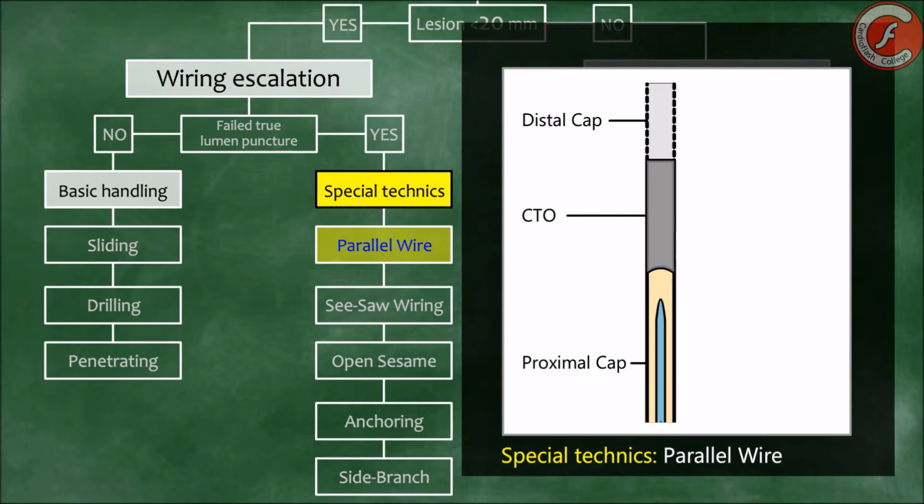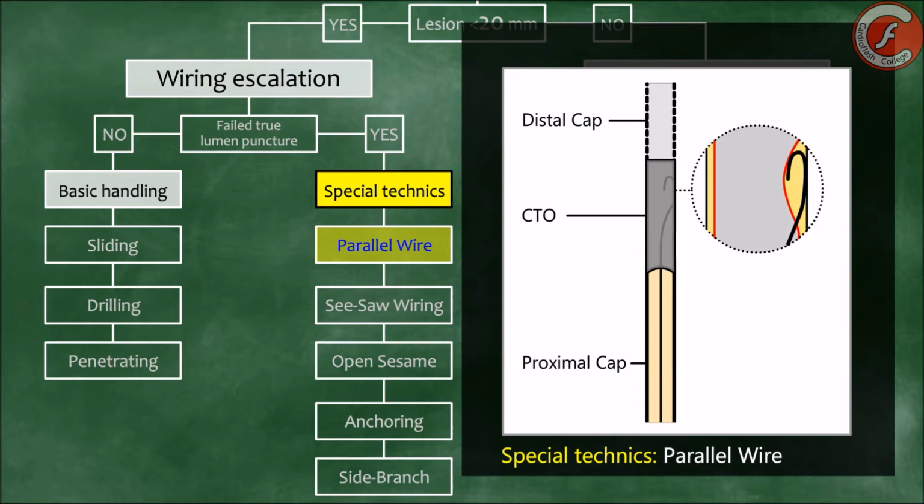It consists of leaving the wandering guide wire inside the subintimal space, removing the microcatheter, and using this device to advance a second guide wire, one that has a different curve and greater penetration power. In this way, we avoid the second guide wire advancing by the same way, preventing the subintimal dissection from progressing uncontrollably and from compromising the luminal crossing of the occlusion, while we change the configuration of the stump and acquire support to cross with the second guide wire. In these cases, the use of dedicated microcatheters with two lumens can ease the procedure.